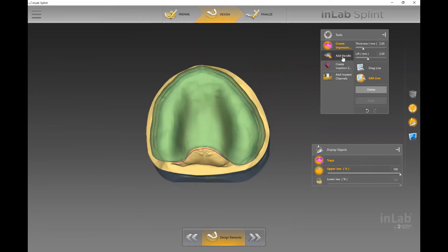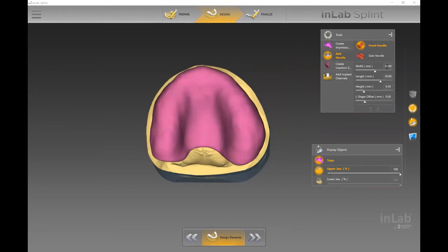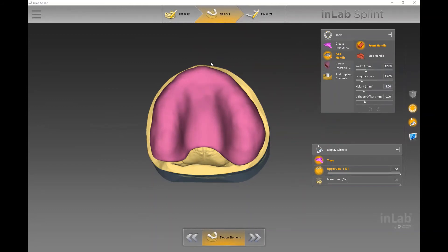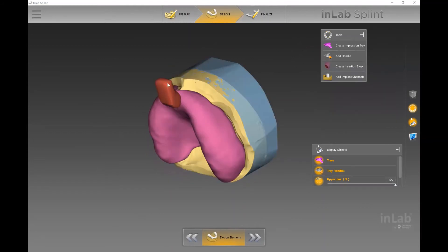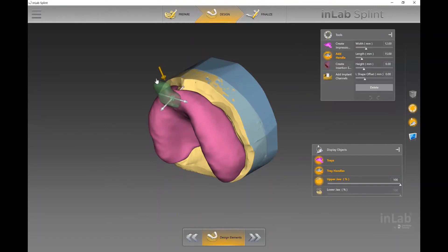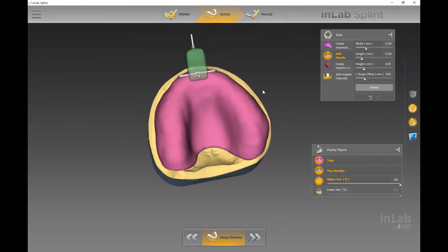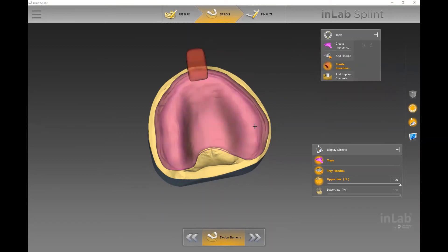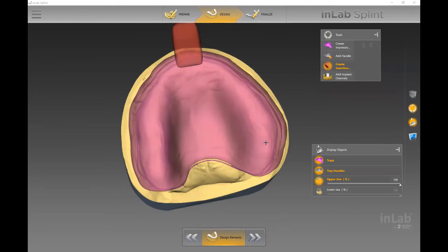Once thickness and lift are taken care of, you can see the material thickness and lift clearly. You then have the ability to add a handle — either a front or side handle — and control the width, length, height, and L-shape offset of the handle. The L-shape offset controls how much the handle protrudes out in an L-shape. Once placed, if you click it with your left cursor it highlights in green, giving you arrows to tilt the handle or physically move it left or right.